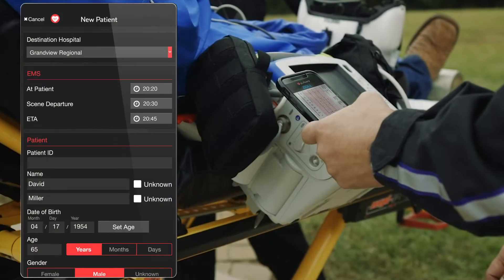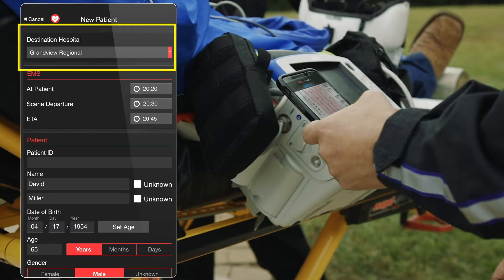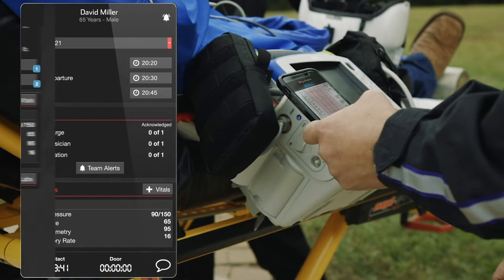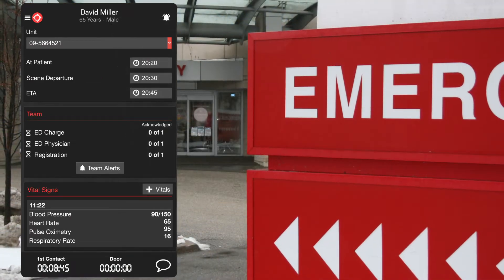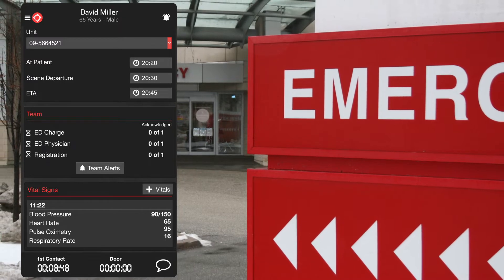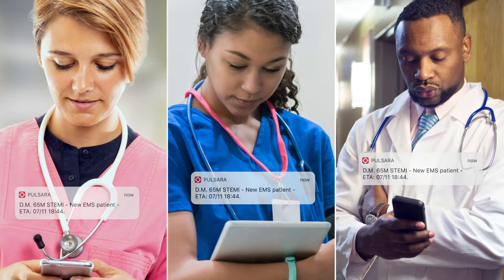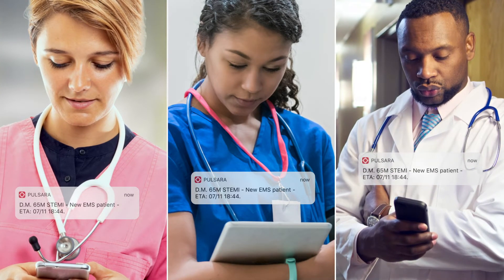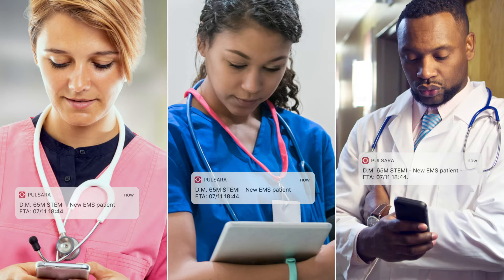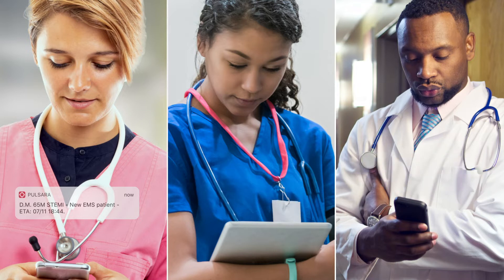The next step is to build your care team. In the case demonstrated here, the medic has already selected the destination facility, so they simply tap alert. The receiving hospital can easily customize who receives this initial alert. In this example, the charge nurse, emergency physician, and registration receive the initial notification. This allows registration to pre-register the patient, and the emergency department has the opportunity to decide if they want to fully activate their STEMI team. This flexibility can help prevent false activations.